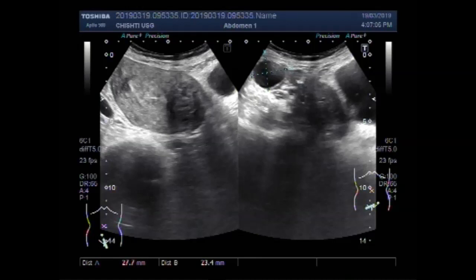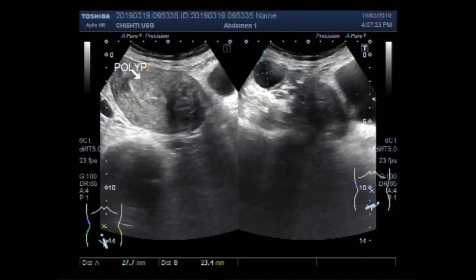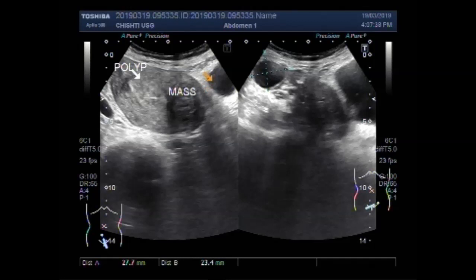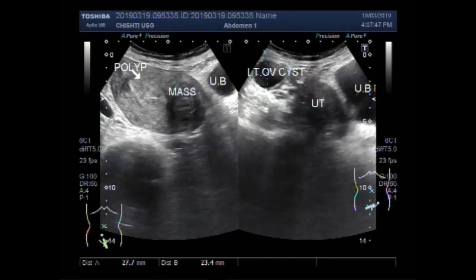The left ovarian cyst measures about 2.8 cm x 2.3 cm. Now we can label this picture: this is the polyp, this one is the fibroid mass, this is the urinary bladder, and this one is the left ovarian cyst, along with the uterus and urinary bladder.